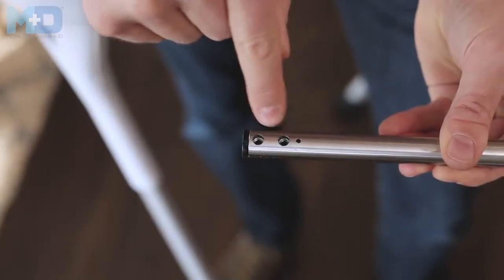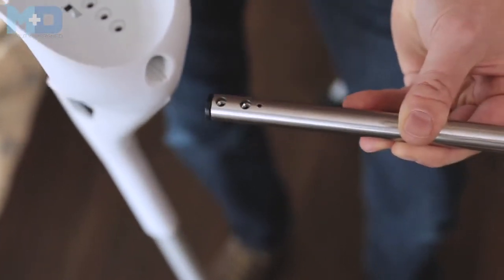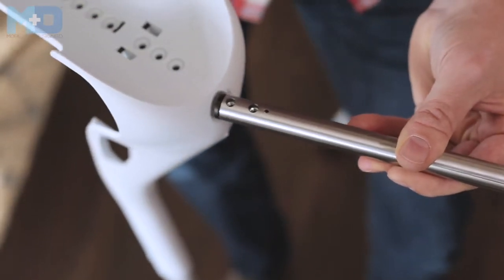On the handle tube, there are 2 different holes that you can put the screw. It does not matter which one you use. They're there so that we can make sure to have every adjustment available for our users.